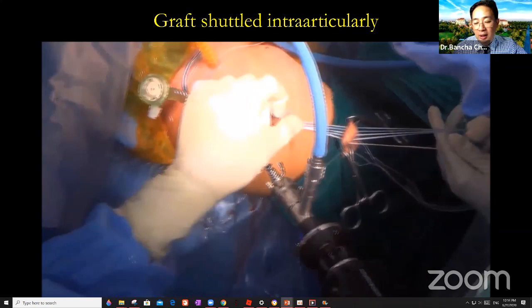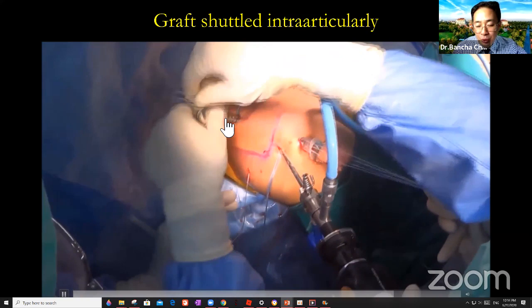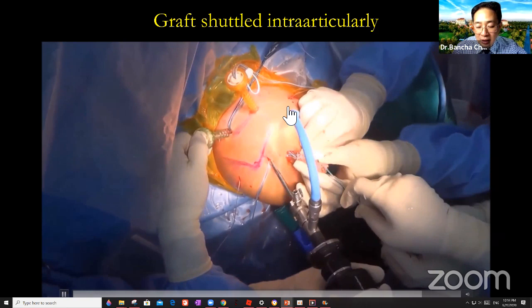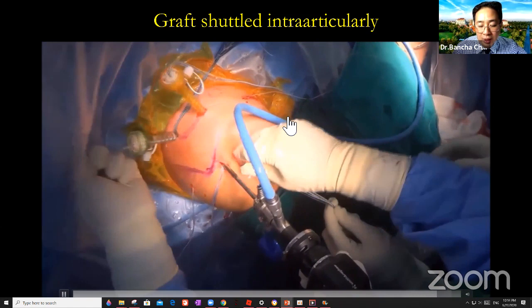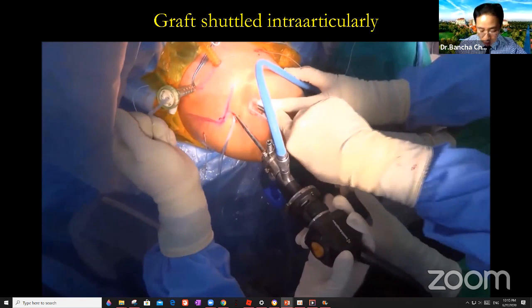The next step is to pass the graft in. So the trick is I put one suture into the Neviaser portal. You see this one? Okay. And then I put it through the Neviaser portal. So this is like one way, one direction. And then you can take this syringe out, because this syringe we cut it, so we can easily take it out this way, okay? And then use your finger to push this graft in. And be very careful not to go upside down, okay? That way. And then put the graft in, okay? This way.